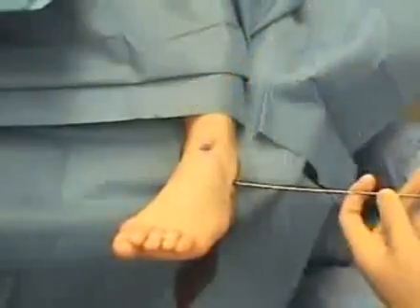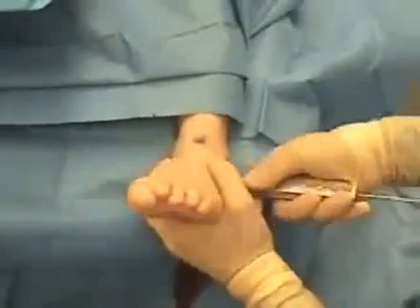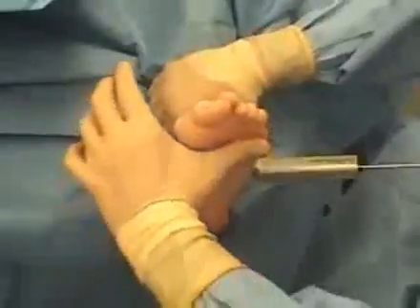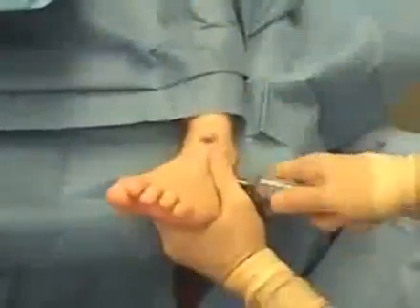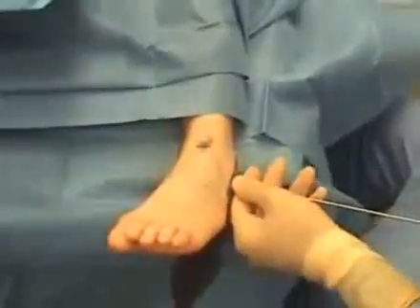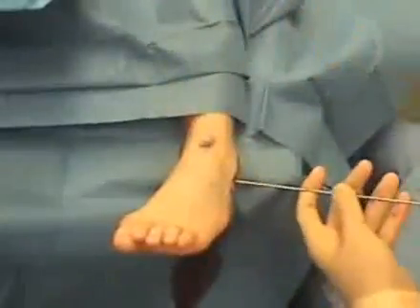Again, here's our size 6 trial sizer. We're going to put it on the guide wire, aim posteriorly to the medial malleolus, push it until it won't go in anymore, and you can just see how we're loading the 4th and 5th metatarsals, and we significantly have decreased that excessive pronation that was occurring in her foot. So we're going to pull that one out, and then we're going to go for the size 7 and just see what kind of correction we're getting with that.